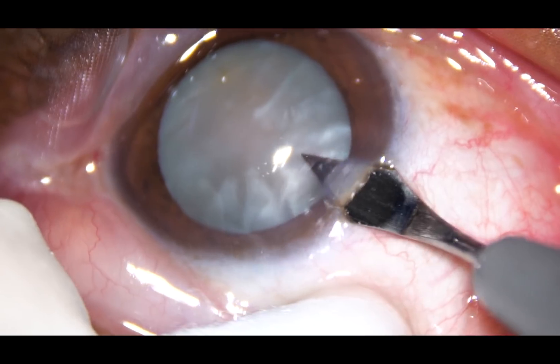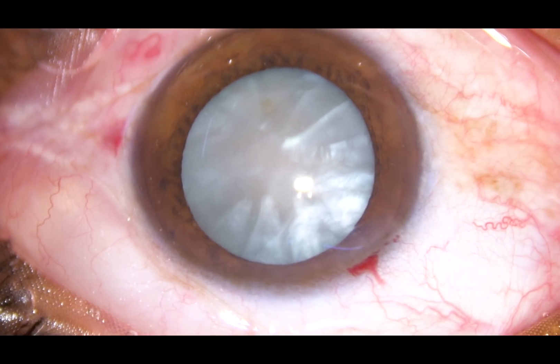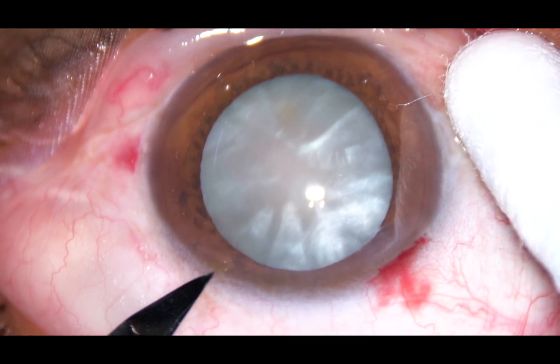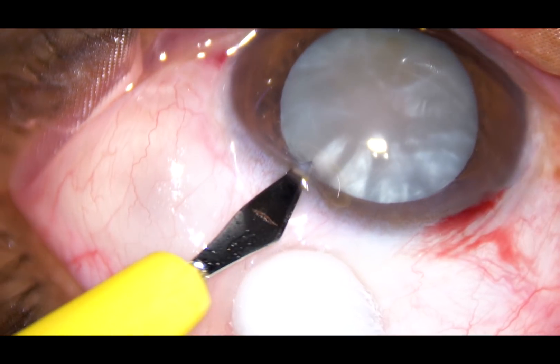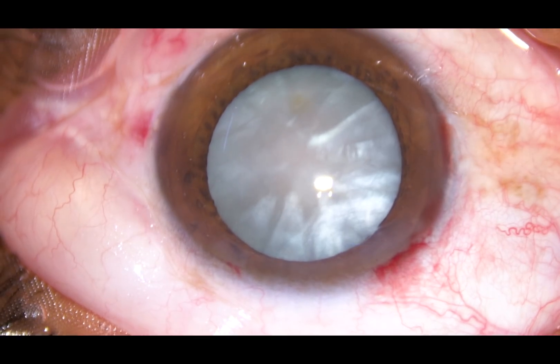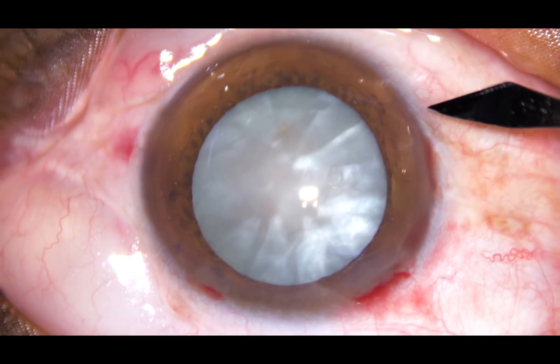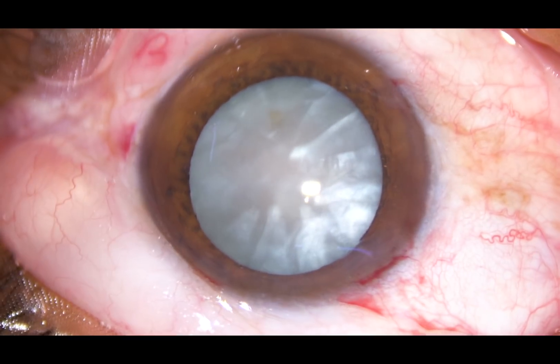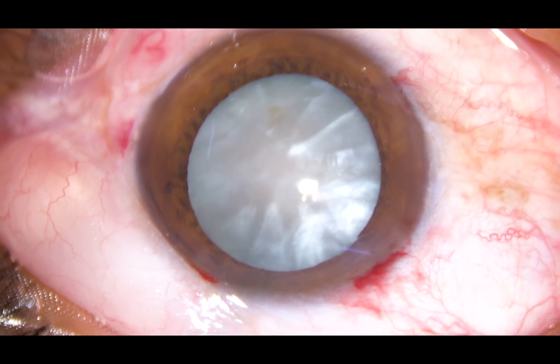This is the main incision on the posterior aspect of the limbus. You can see oozing of blood from the incision. This is a side port on the left side of the main incision — a very small side port. And this is another small side port on the right side of the main incision.